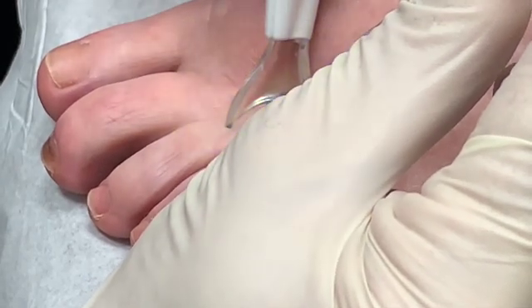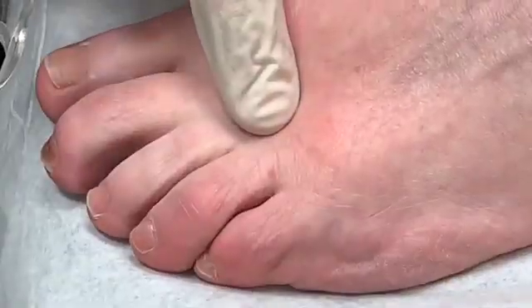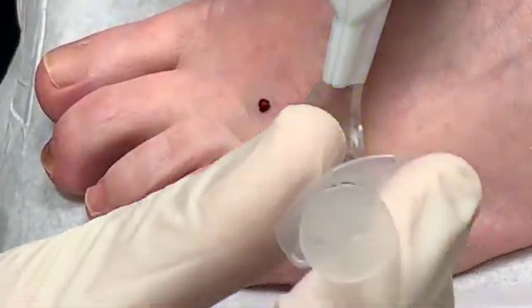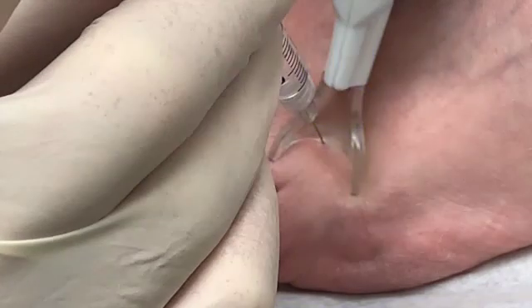And there's one interspace. Then we move it to the other one over here. And that's the third interspace.